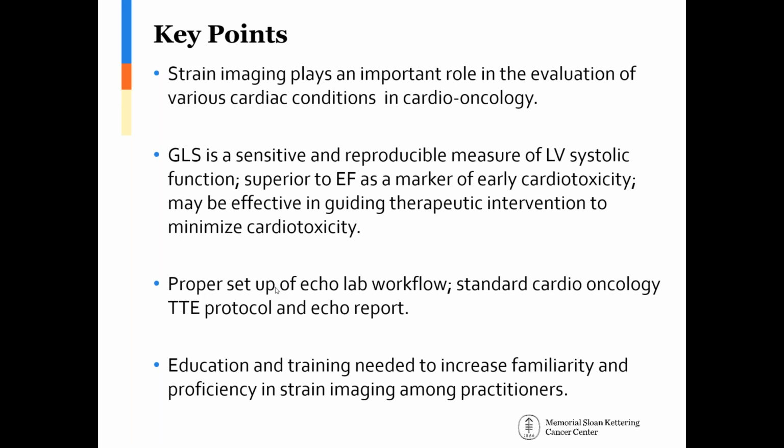And they all had the common theme that they don't really think strain is that helpful. I even did some research with sonographers, and the variability between sonographers was substantial. So I wonder if some of the lack of adoption of strain is related to that. There can be significant variability in reproducibility among sonographers unless they are thoroughly standardized in their training.